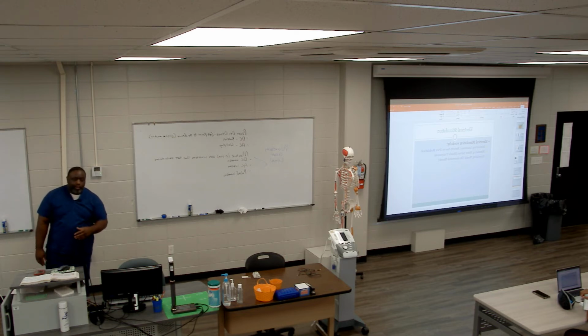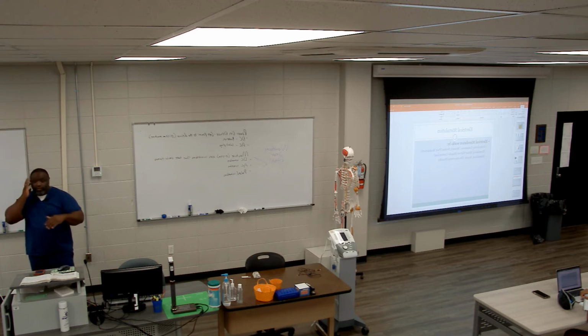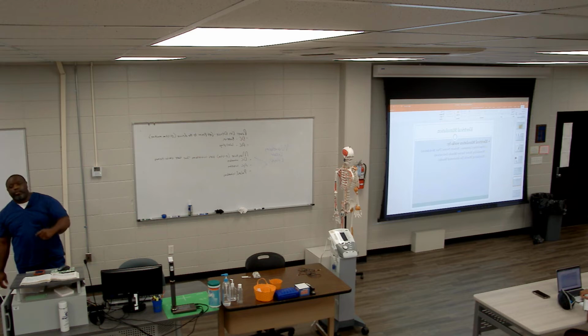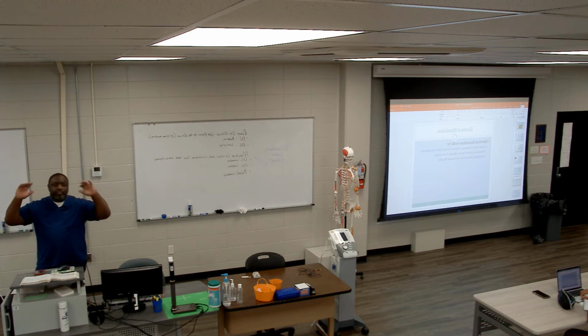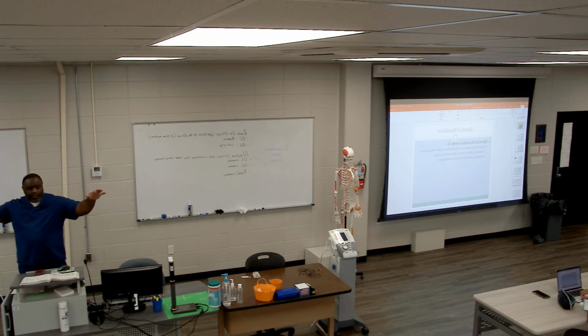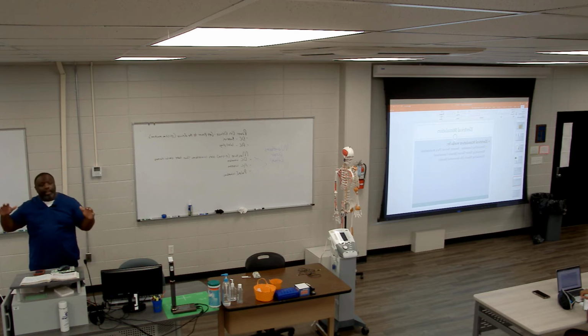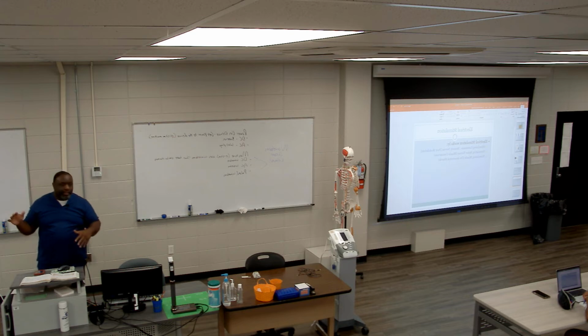So I'm either trying to stimulate cutaneous or sensory nerves. Doing this is usually going to help me reduce pain. So if I'm trying to stimulate cutaneous or sensory nerves only, I am usually trying to bring down pain.